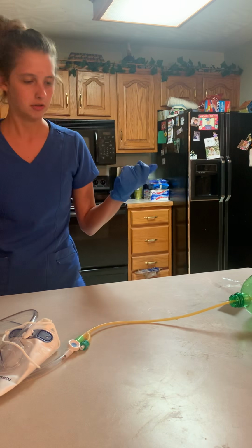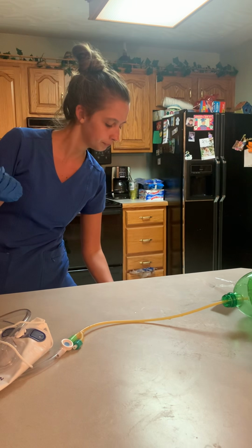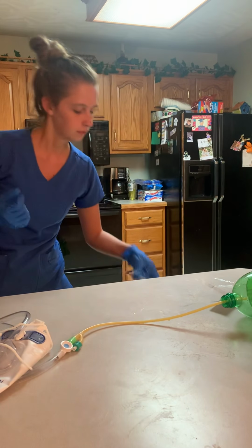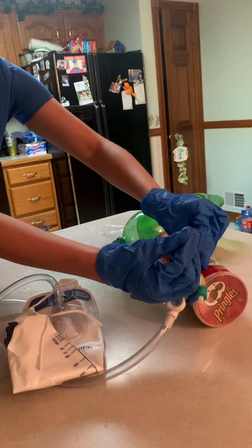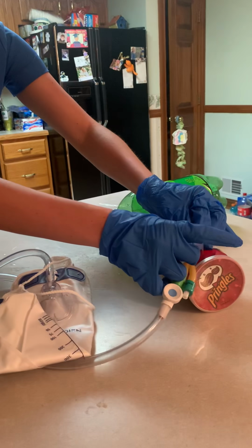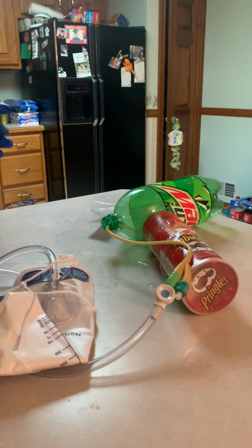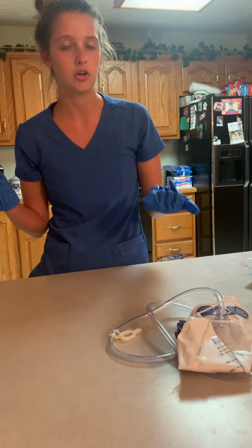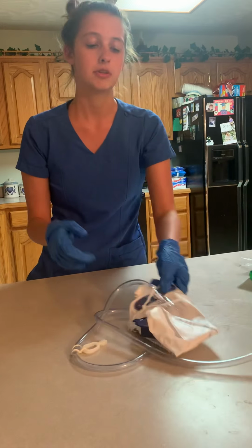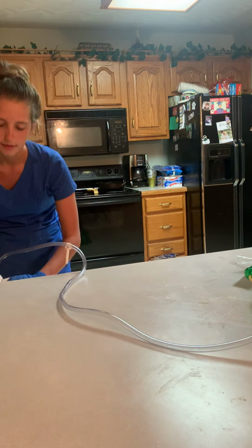And now what I'm going to do is tape the catheter to the patient's leg, and I'm going to make sure that there is no straining when doing this. I'm going to make sure that it's not pulling, or it's not too tight. And then if we were in a regular hospital bed, I would attach the bag to a non-movable part of the bed. And when doing this, we're going to make sure that we keep the bag at all times below the bladder.